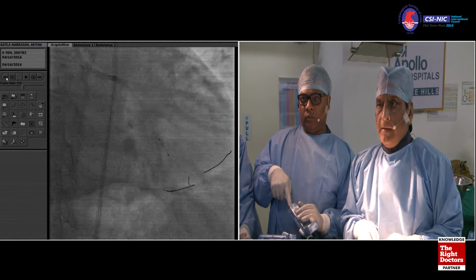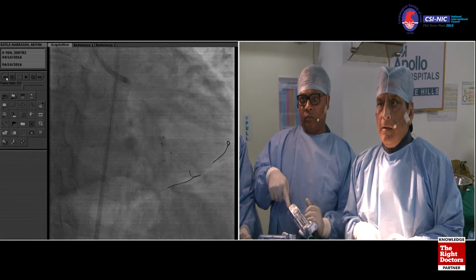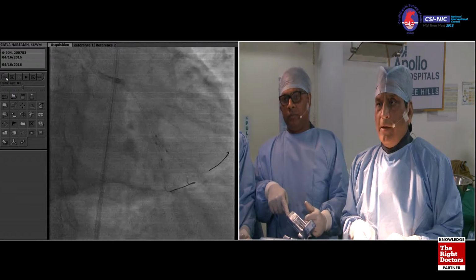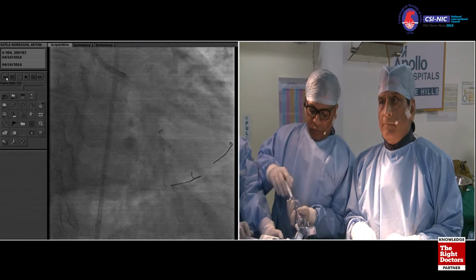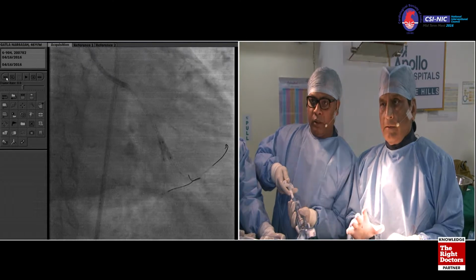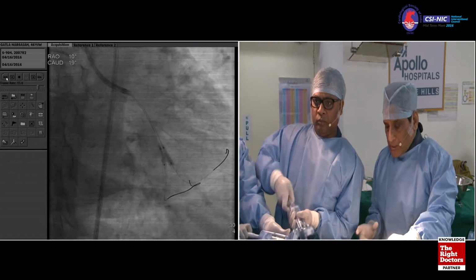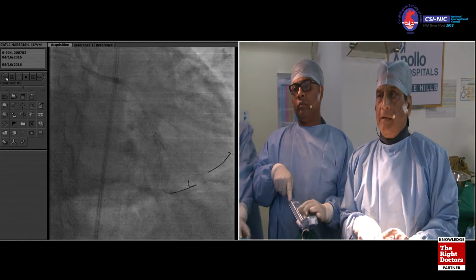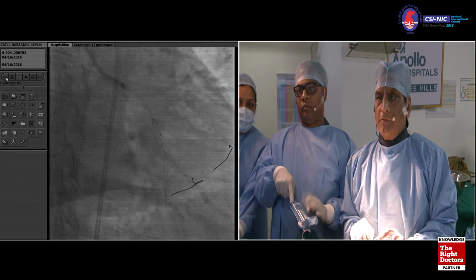Just one second. In kissing, is it important to keep the balloon markers at the same point? Well, we can do that just proximally again. The vessel is just about there. Good. Go to 10. 1, 2, 4, 6, 8, 10. Good. Don't do more than that. Negative. Clearly, the proximal vessel has to be two-thirds of the aggregate stent or balloon diameter. So we are done now.